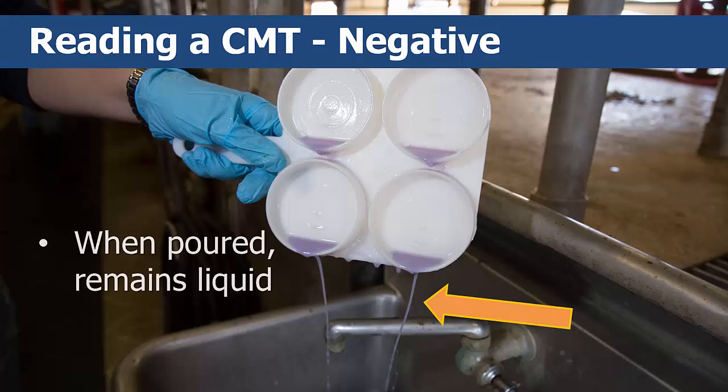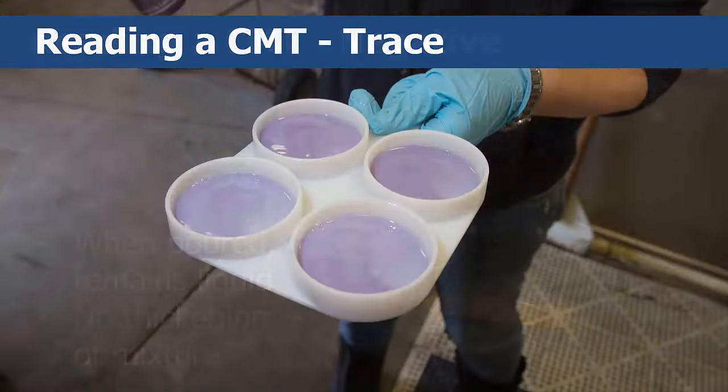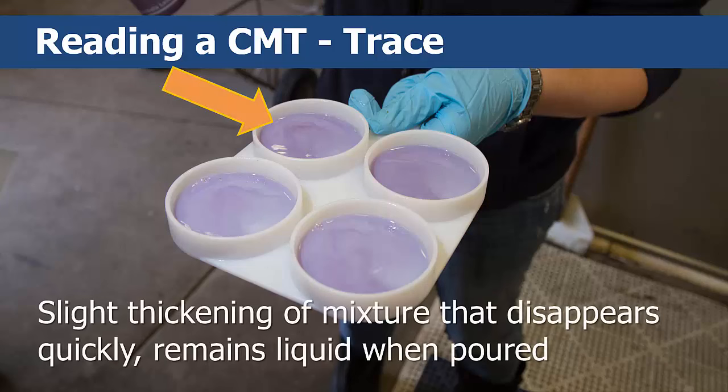If the mixture remains liquid and you do not see any thickening, the cow is not infected and the test score is an N, or negative. If the mixture thickens slightly but then the thickening disappears the longer you rotate the paddle, the cow is possibly infected and the score is a T, or trace. Note: if one to two quarters read trace, the cow is considered okay.